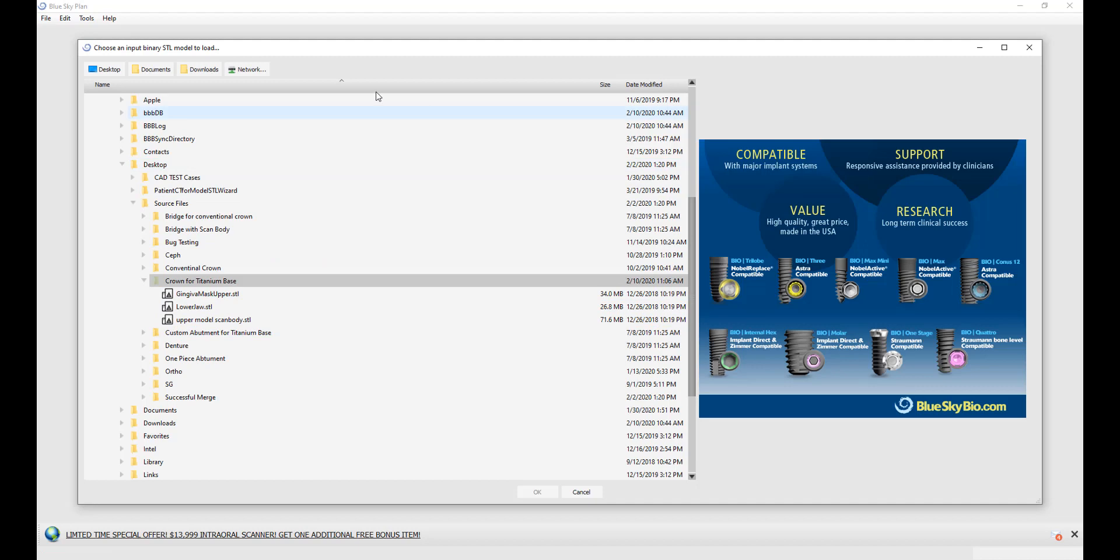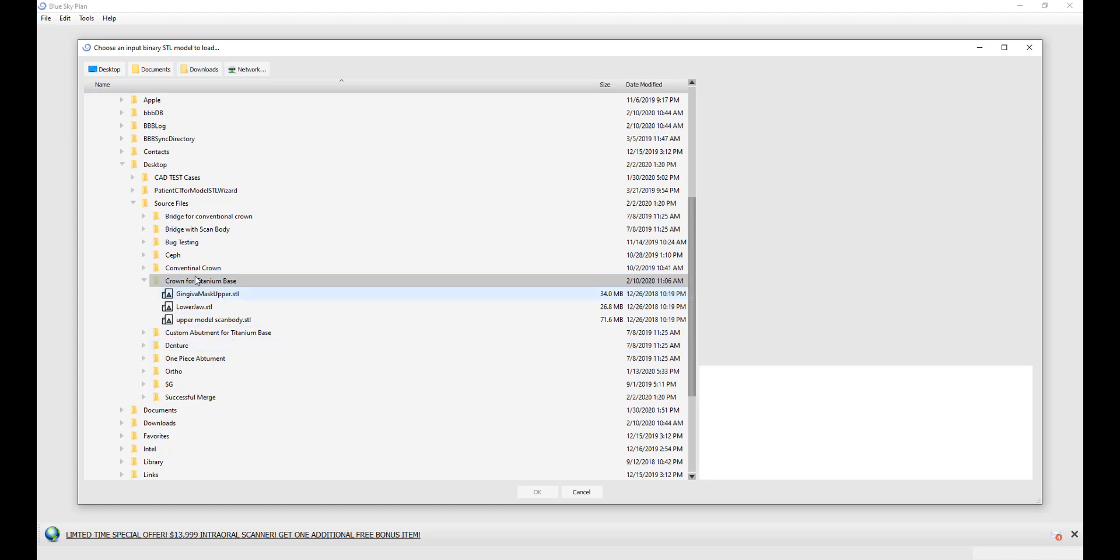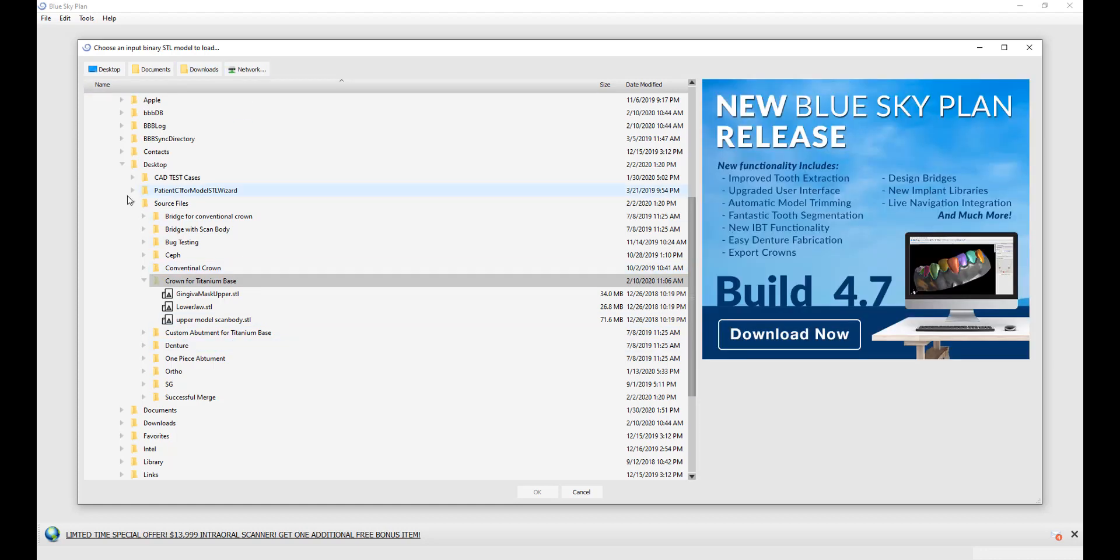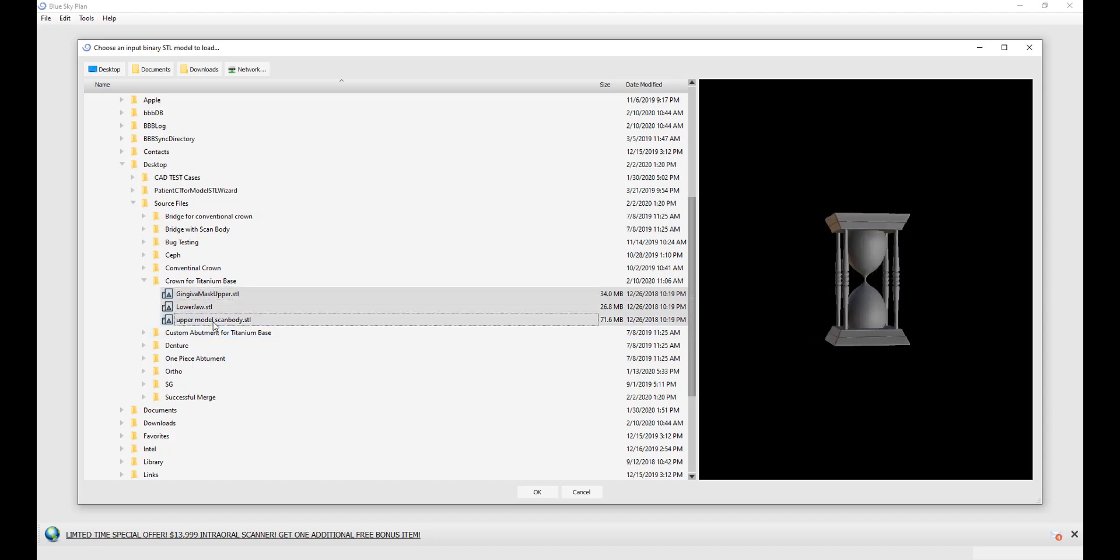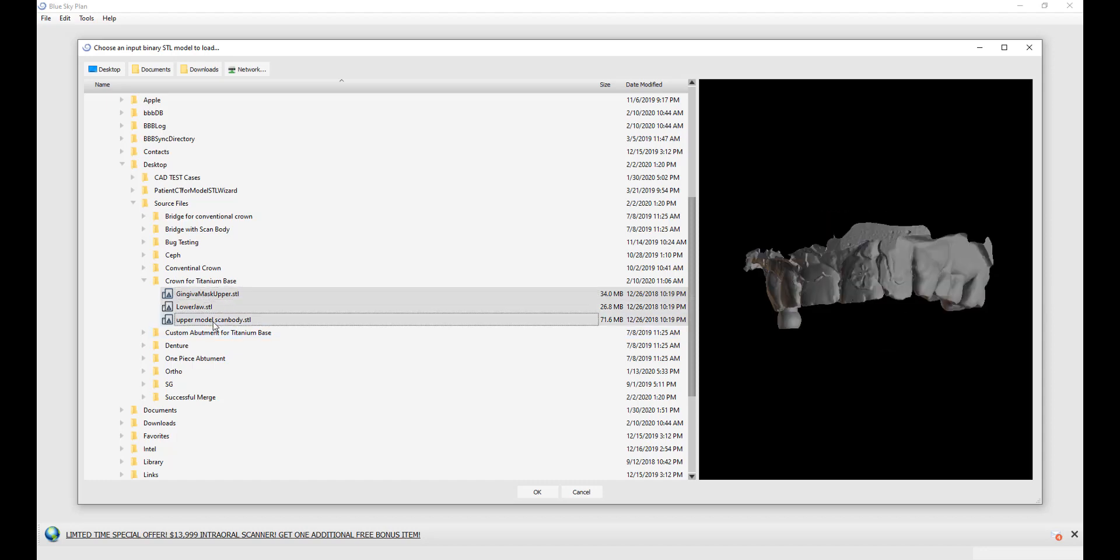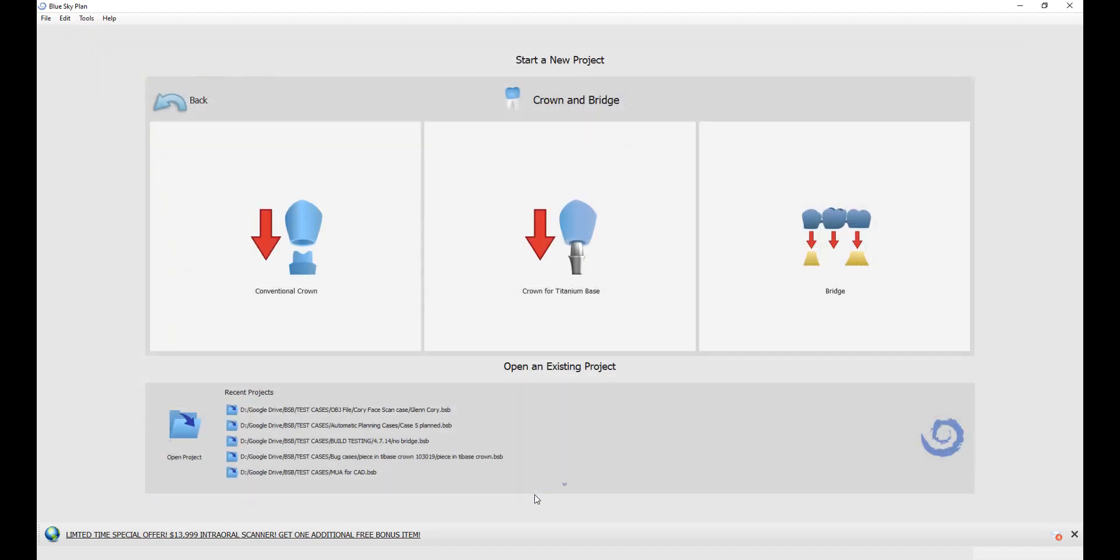The software brings up the directory on our computer. We have the shortcut buttons on top for desktop, documents, downloads, and network. Navigate to the relevant folder containing the STL files. You can multi-select by clicking on the first one with your left mouse button, holding down the shift key, and then clicking on the last STL model. The software will select the models listed in between. Clicking OK, and now the software will load the models.